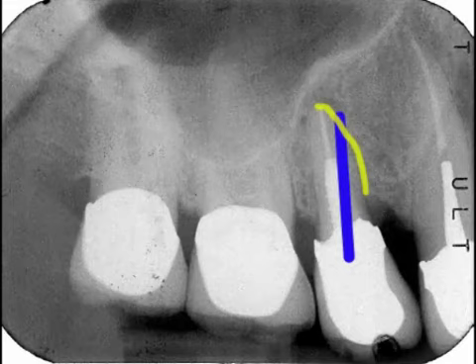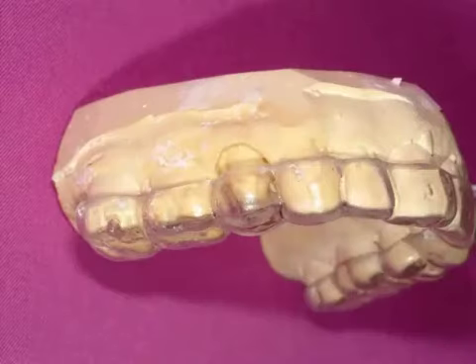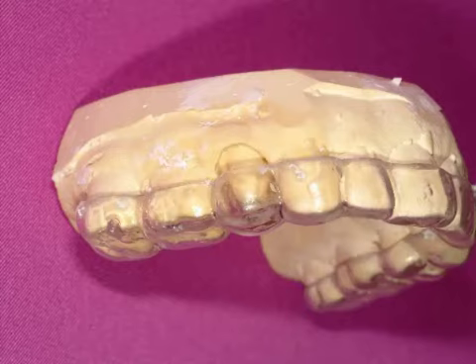Well, now that I'm getting into middle age, I want everything that I do in my practice to go as smoothly as possible and have as few complications and whoopses as I possibly can. And so that's one of the reasons I've really embraced guided implant surgery with open arms. So that's what we're going to do in this case: we want to get this implant in just the right position so that it's right where we want to have it. And we want to be able to do that very accurately and very predictably.